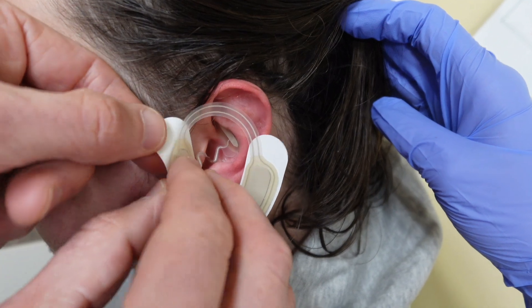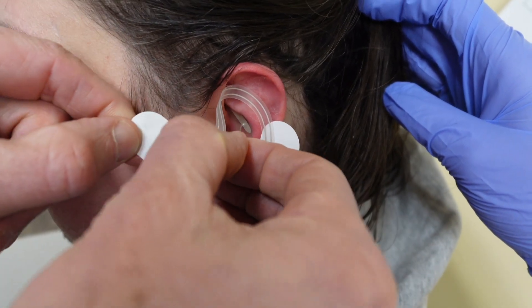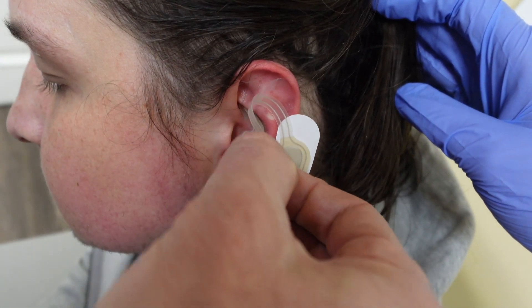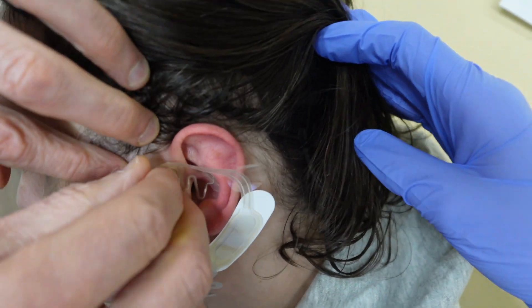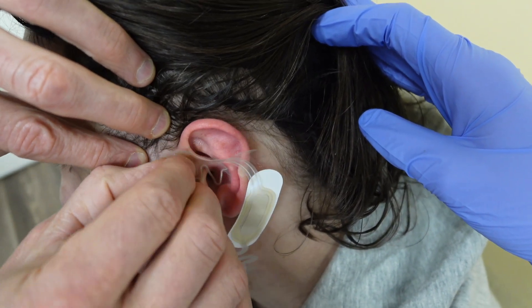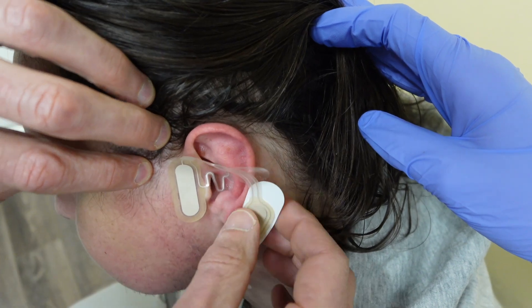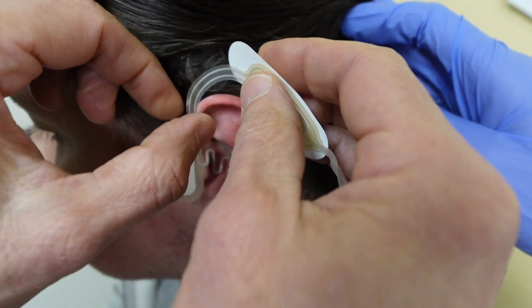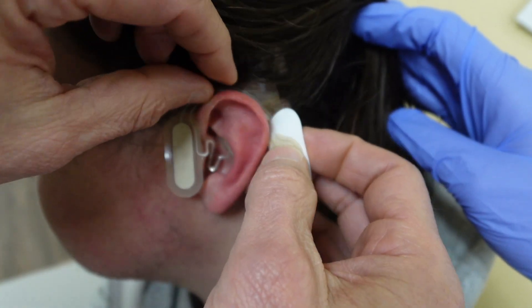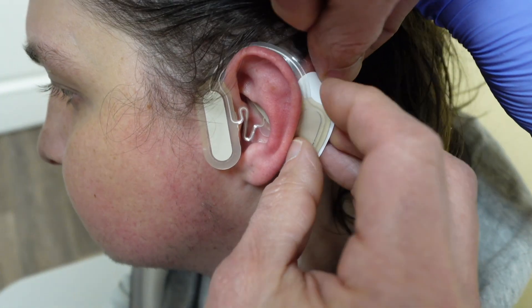This patient in the testimony said he had repeated trouble with the decal sticking to his head and was getting error messages. So that might be an issue — it seems pretty picky. We just get the hair out of the way, clean the skin, make sure the patient's dry. With longer hair it's a little more challenging, but these apply really simply just like that.